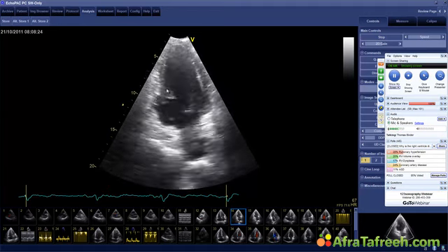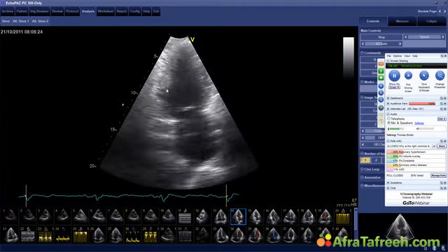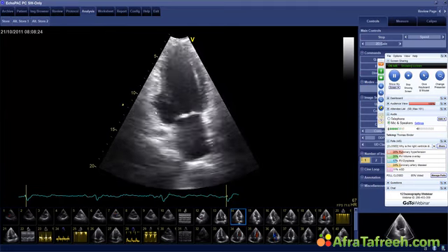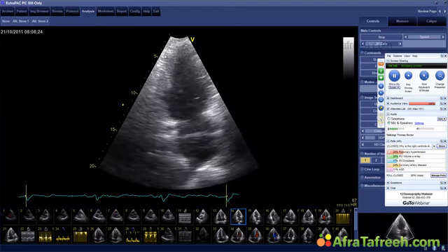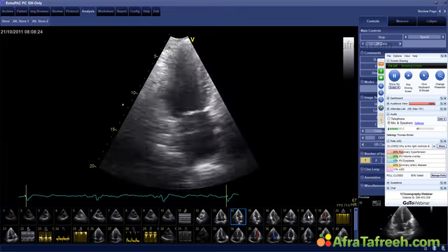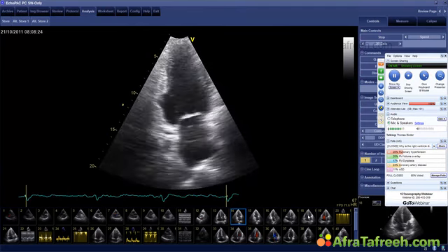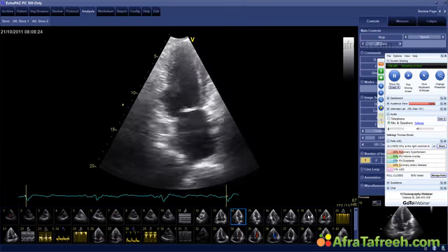Now, the infarct or the event the patient had was 3 or 4 months ago. So in reality, once it's over 4 months, you would not see rupture anymore. It's because the tissue is so fibrotic that there is no rupture. But the main point here is he had an inferior infarct, and if you have an inferior infarct, there is also the risk that you might have what? Does anybody know the answer? Does anybody want to answer maybe?